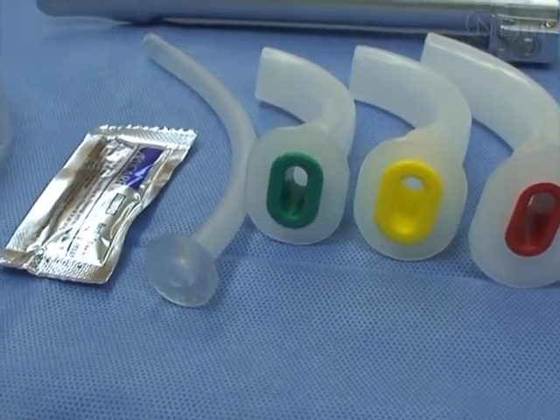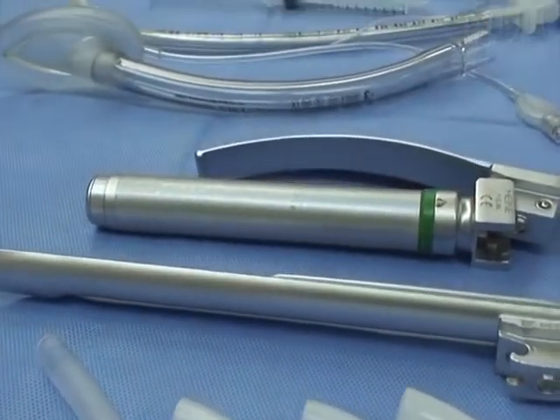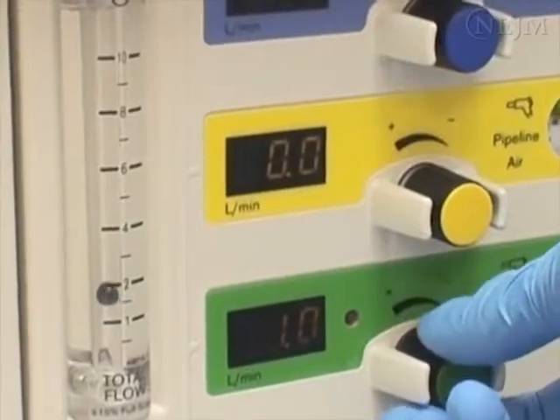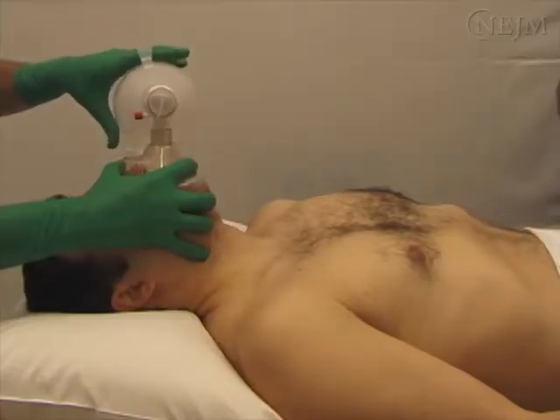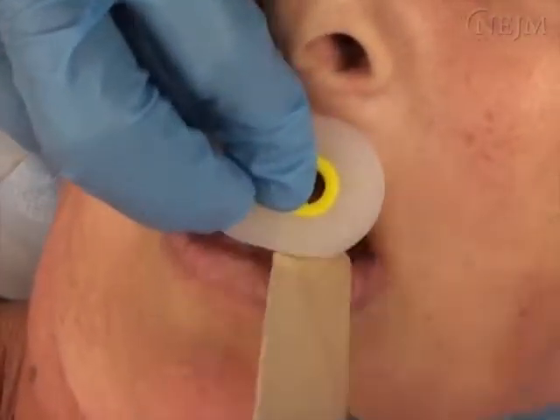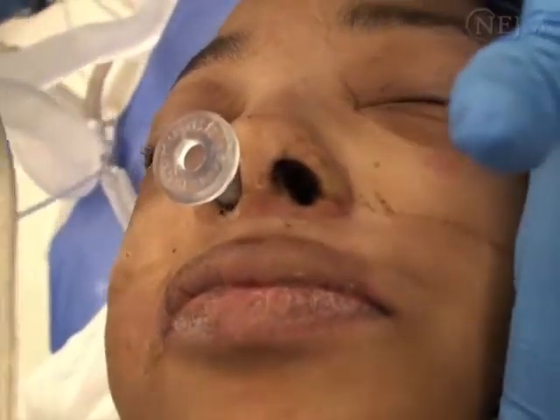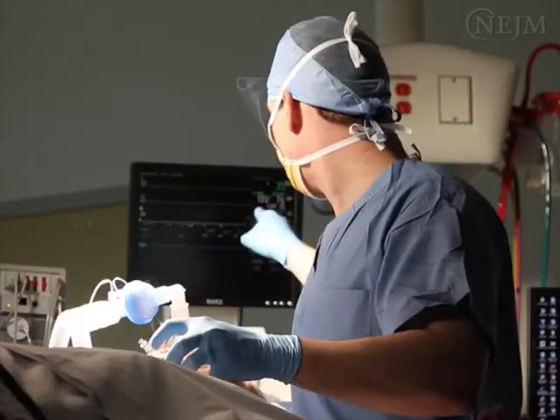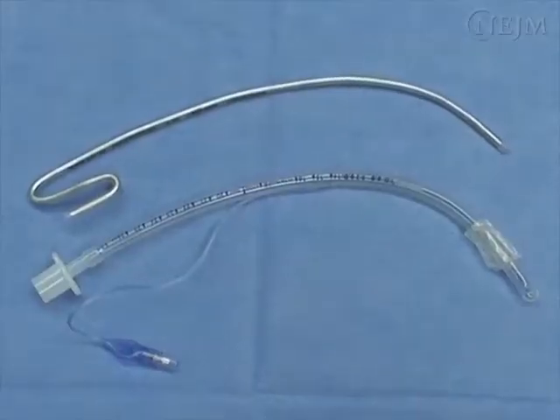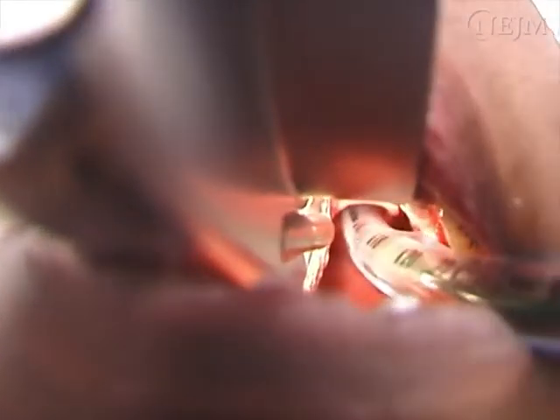Equipment selection is guided by the need to prevent complications and to maintain airway patency, oxygenation, and ventilation. A suction device for removing airway secretions, supplemental oxygen, and an appropriately sized face mask with a bag valve device must be immediately available. Oropharyngeal and nasopharyngeal airways should be readily available in case one needs to be placed to improve airway patency. The patient's vital signs should be monitored continuously.